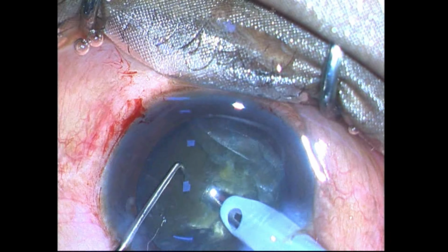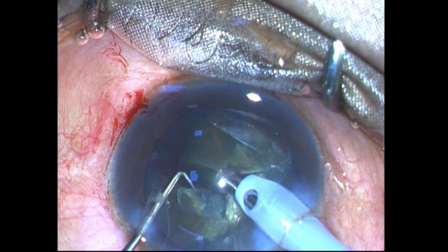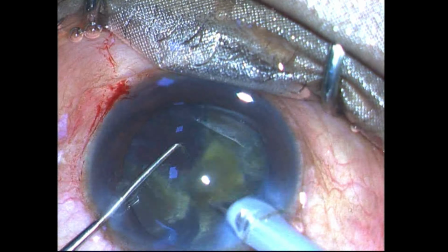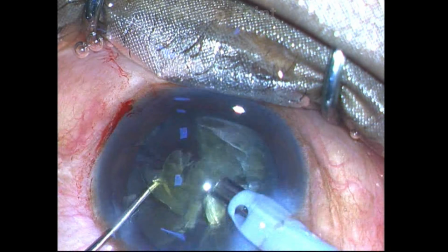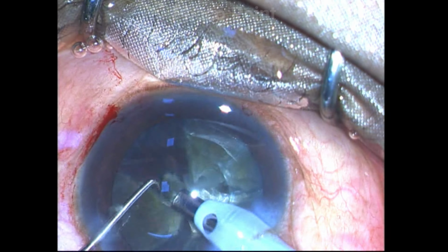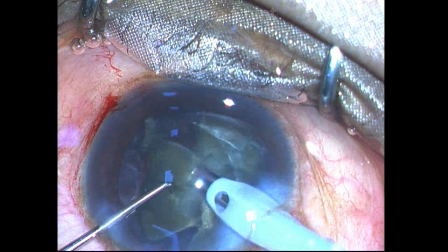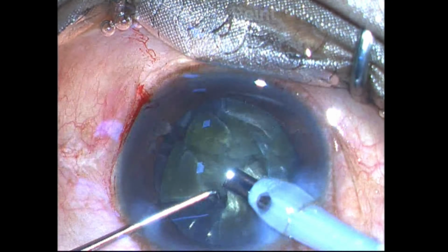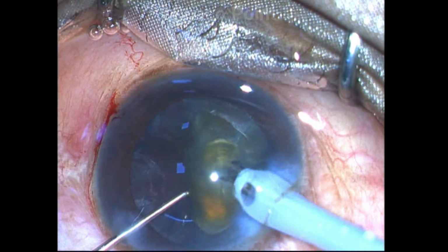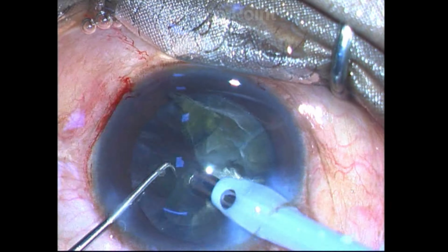The nucleus is rotated, the surgeon impales in 3, holds in 2, separates and back to 1. Now this fragment has come up while holding it in foot pedal 2 and the surgeon thus further emulsifies it with the chopper lying on its side. Turn by turn now, it's time for fragment emulsification, and you can see how each and every fragment is subsequently downsized and emulsified. So during fragment emulsification, your foot pedal control goes like this.